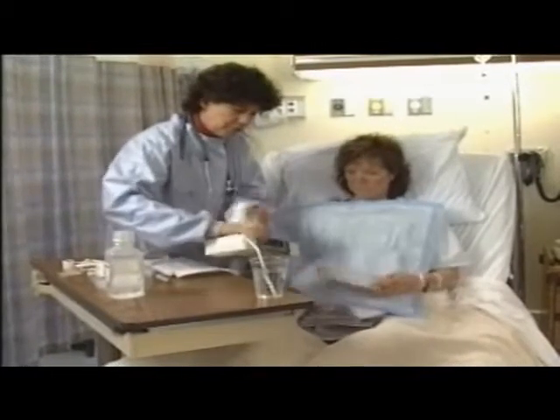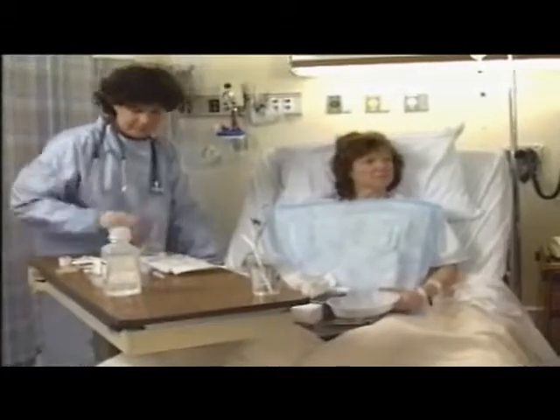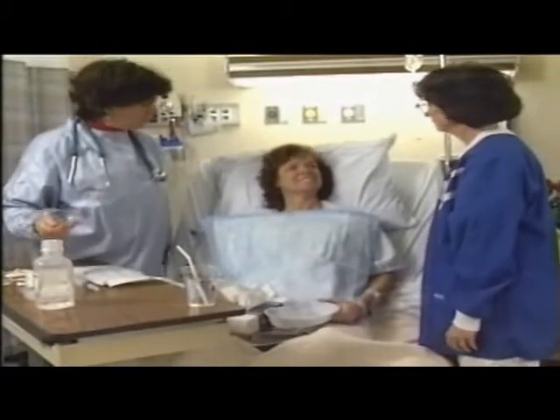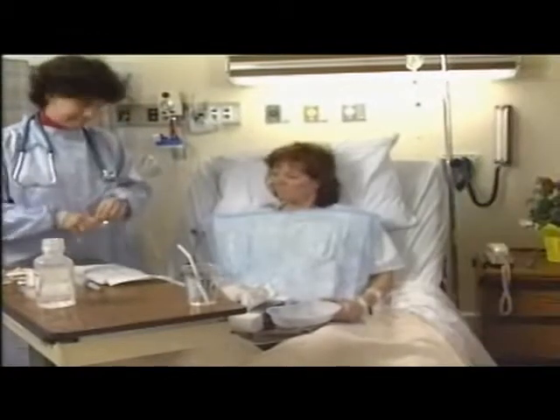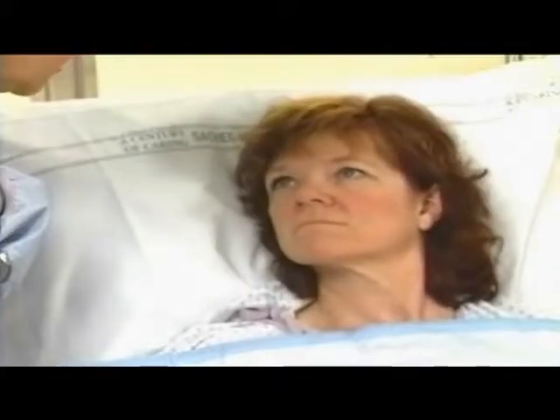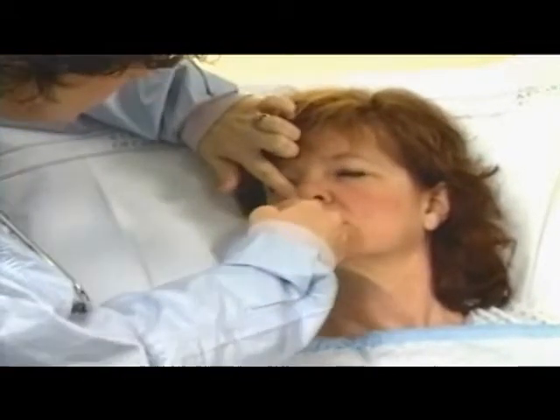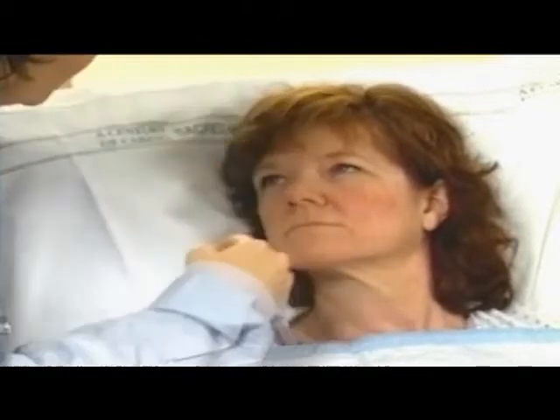If the patient is confused, disoriented, or unable to follow commands, request assistance from another staff member. Review the patient's health history for facial or nasal trauma or surgery, including any history of bloody noses. Close one nostril and then another with a finger and compare the force of exhalations. We'll use the left side because there's more airflow that way.